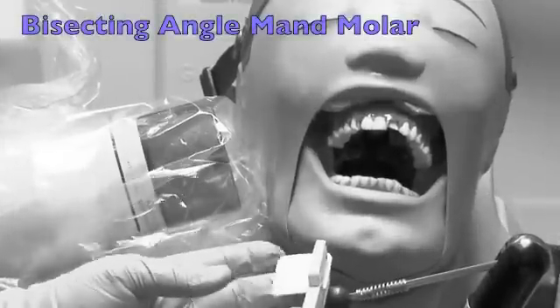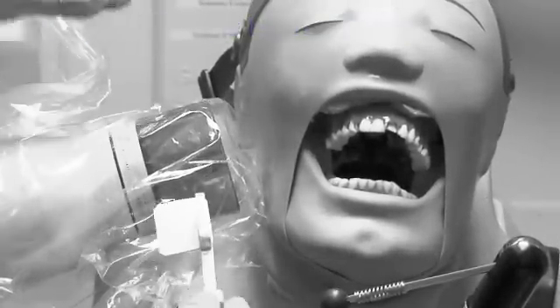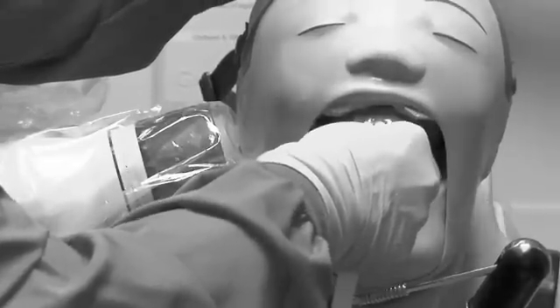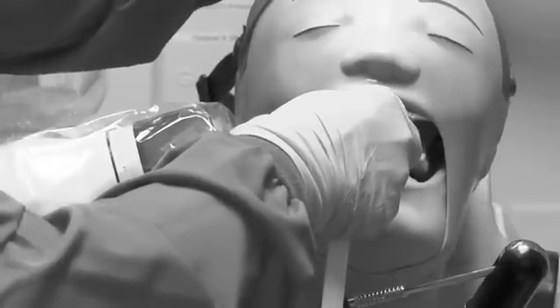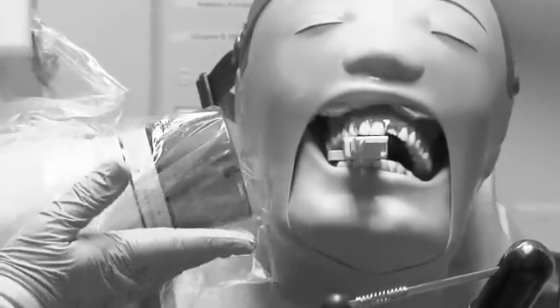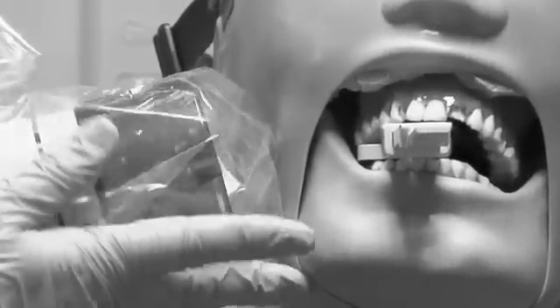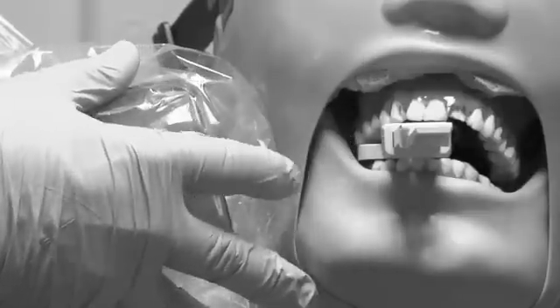Now we're going to the mandibular. Our patient has raised up his chin. We now have a negative angle, a minus ten degrees. We want to see the distal root of the last erupted molar — in this case there's a third molar — so the front of our film will be at the mesial of the six-year molar. To line it up, align the PID with the border of the mandible, coming between the two red lines, so your film is covered and you will not cone cut.